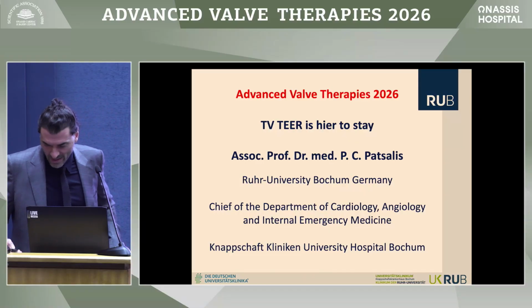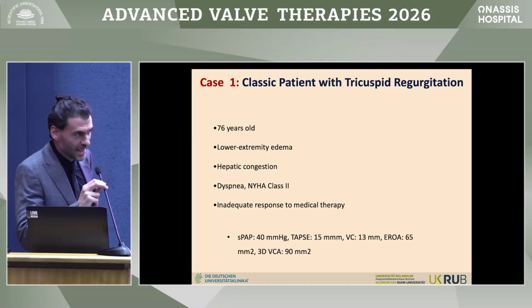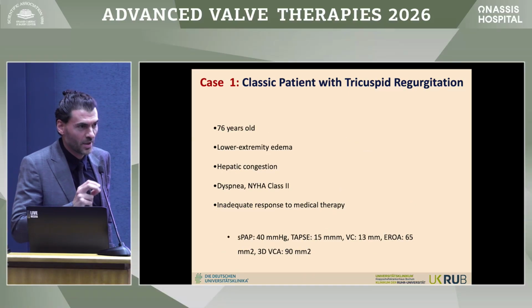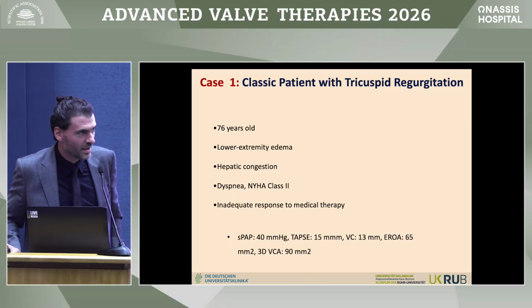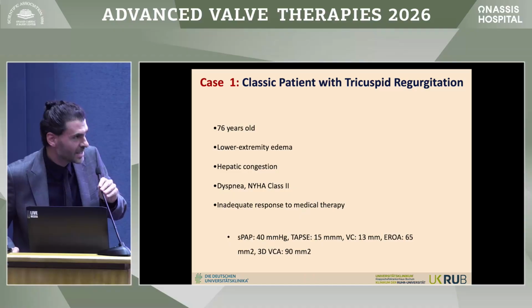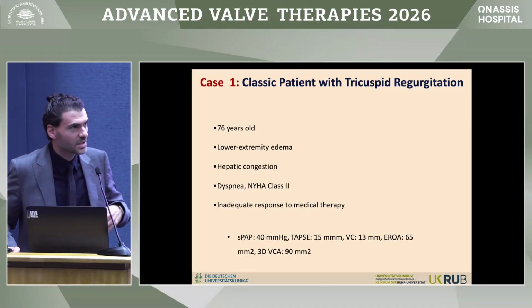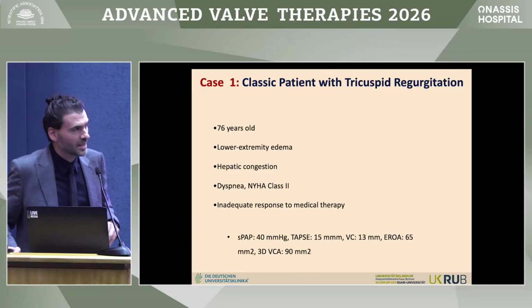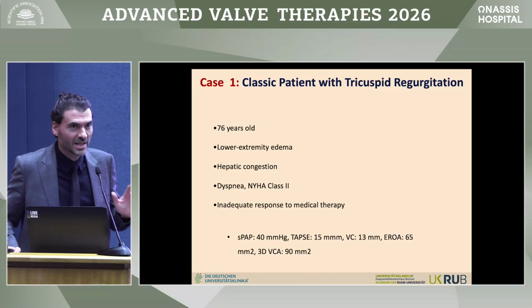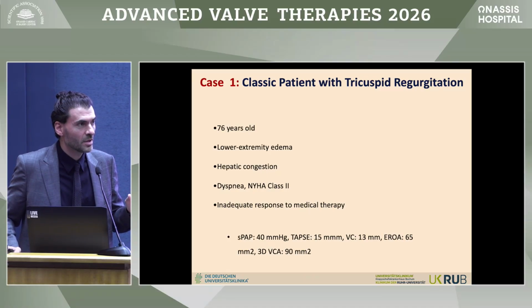So I will try, because it's Saturday and it's summer, and I think we all also think about the weather outside. I'll try to show you two cases. The first case is going to be just a normal, let's say, boring tricuspid case, and the second one is going to be really a catastrophe. And we're going to try not to do tips and tricks. How do we handle the device in order to achieve the result that we want?